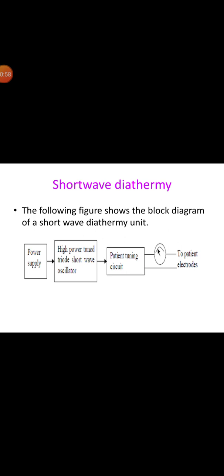In addition, shortwave diathermy can be used in medicine for treating damaged tissues and relaxing muscles. The electrical pulse of shortwave diathermy creates heat deep inside a targeted tissue, reaching areas as deep as 2 inches from the skin surface. While the diathermy machine doesn't apply heat directly into the body, the current created by the machine allows the body to generate heat within the targeted area itself.